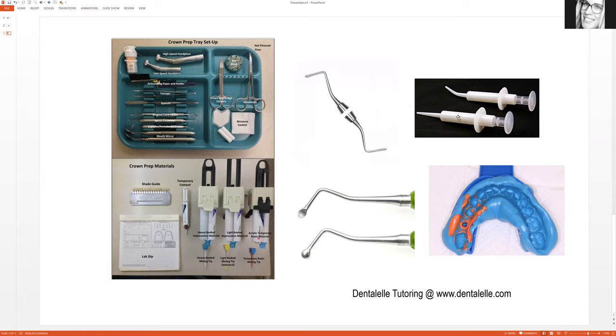The dentist cements the temporary crown inside the mouth — no light curing needed. Excess cement is cleaned up with an explorer, and the bite is checked. Care must be taken not to adjust too much since temporary crown material can crack. Temporary crowns are meant to last a couple of weeks until the patient returns for the permanent crown.